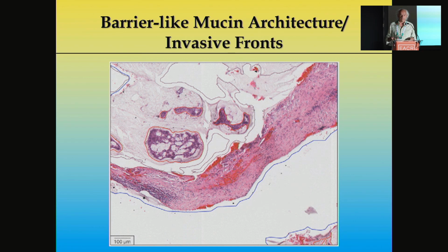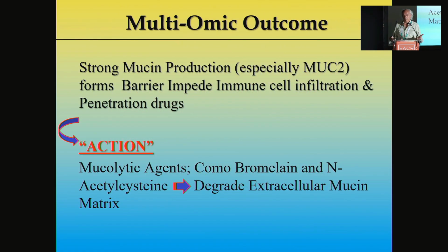So what you see here is really cool. The lower part of the red in there, that's very chewy, very stagnant. It's actually glycoproteins, and it forms a barrier. It's like a mountain. So that means that immune cells and drugs cannot penetrate. It's like a barrier. That means that the tumor can grow. And that's the way the system builds itself.